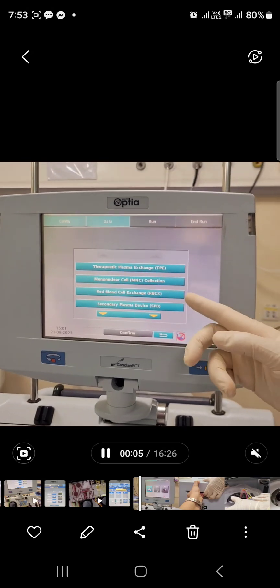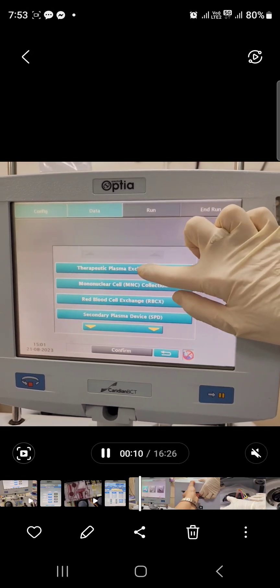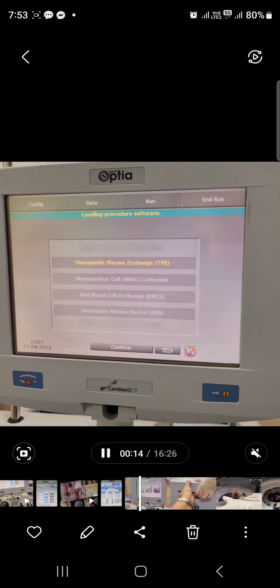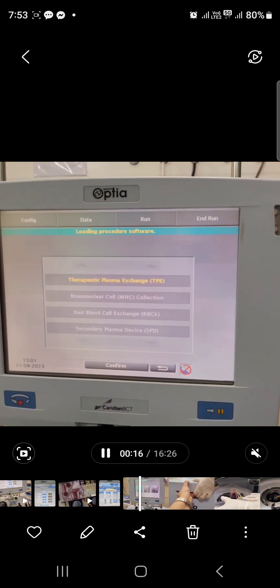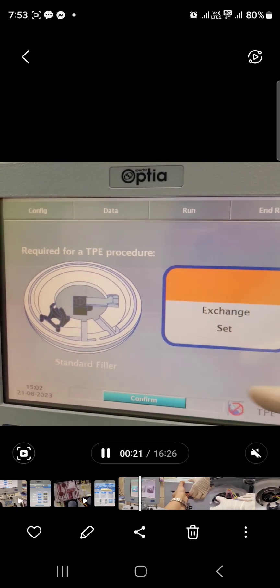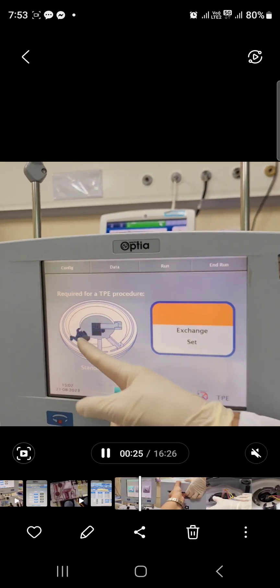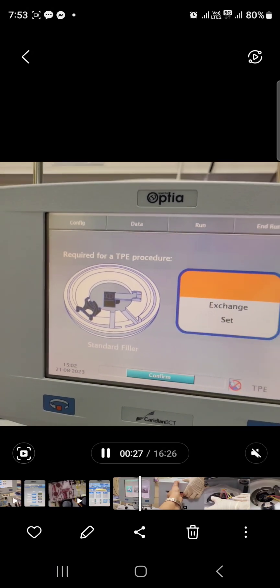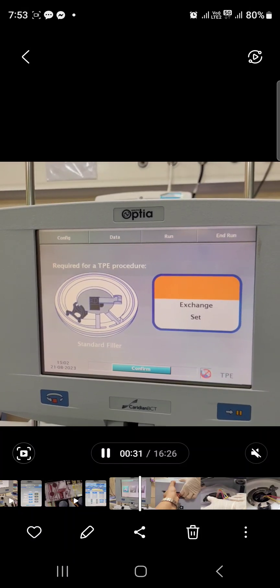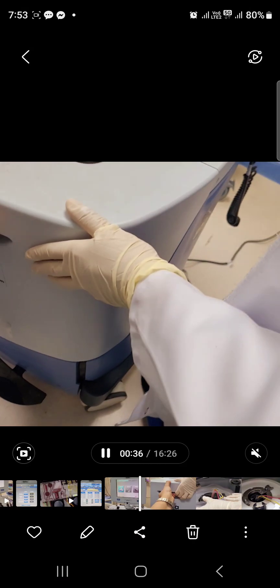Selecting procedure will be based on your doctor's order. For this time, we are using therapeutic plasma exchange. Then afterwards, select confirm. Wait for the process as it is showing loading procedures software. Once it's loaded and settings are completed, take the kit used for plasma exchange, which is colored orange. Then confirm once you have chosen the set.